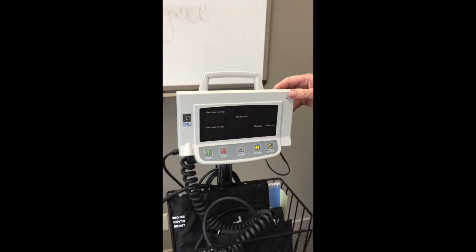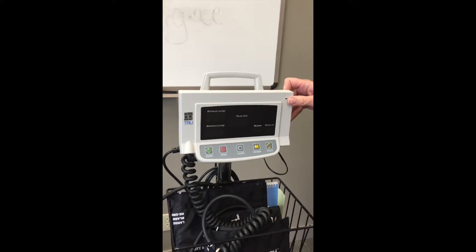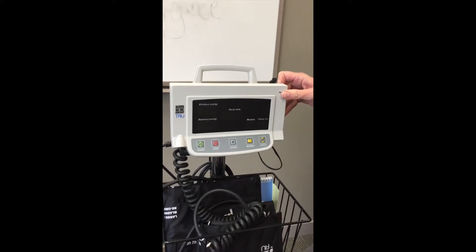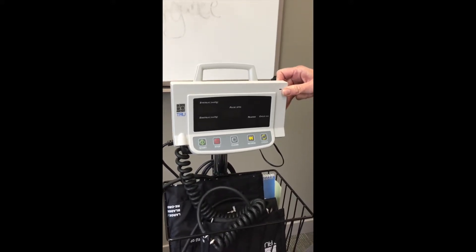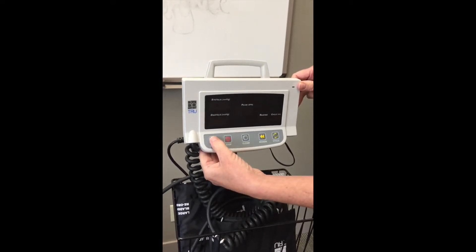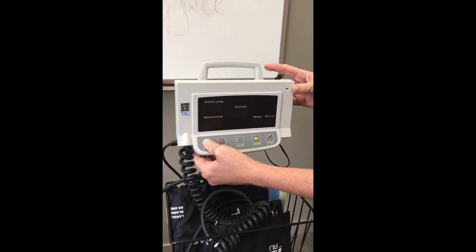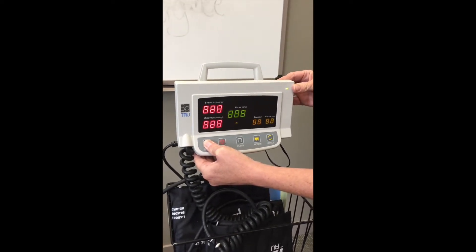Sometimes the readings on the machine feel incorrect, so in order to recalibrate your machine — which would be similar to rebooting a computer — have your machine turned off. Put your finger on the start button and hold it down, then turn the machine on at the back.